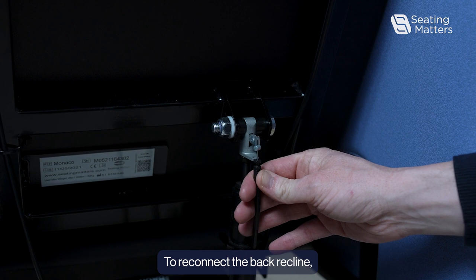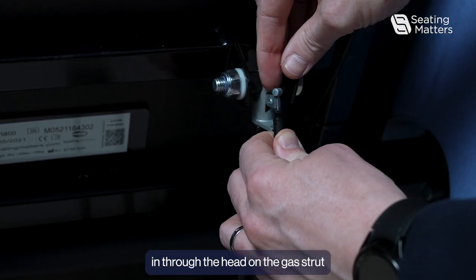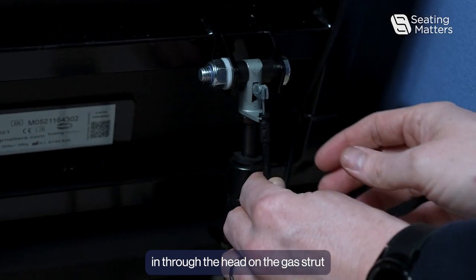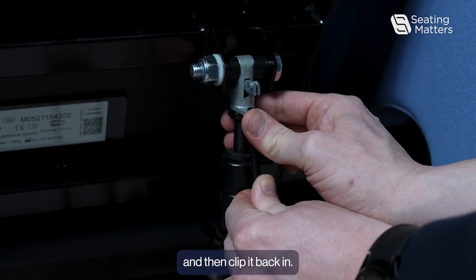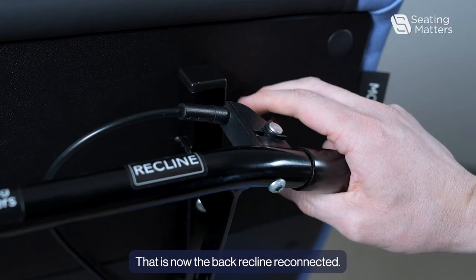To reconnect the back recline, we have to feed the barrel on the end of the cable through the head on the gas strut and then clip it back in. That is now the back recline reconnected.